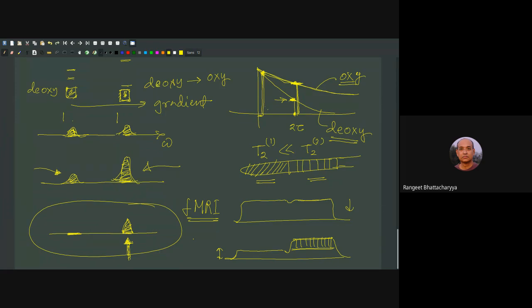But is it a good method, in the sense that does it actually detect the brain functions? It does not always work very well, simply because not everybody's brain is exactly identical. And even when you are playing a song, you do not know what kind of activity the brain is involved in. The thought process cannot be controlled exactly that way.